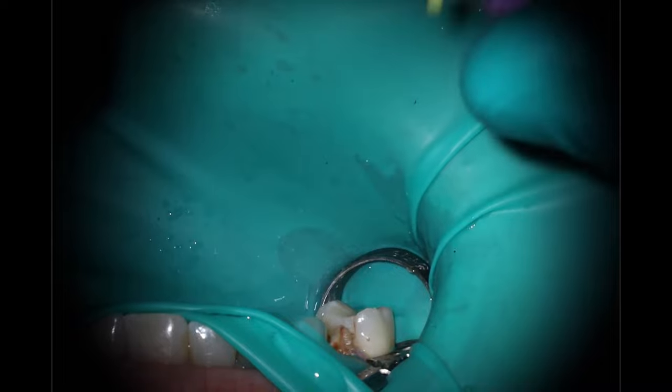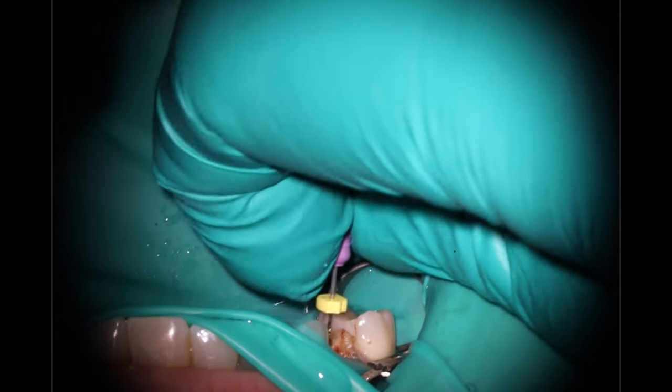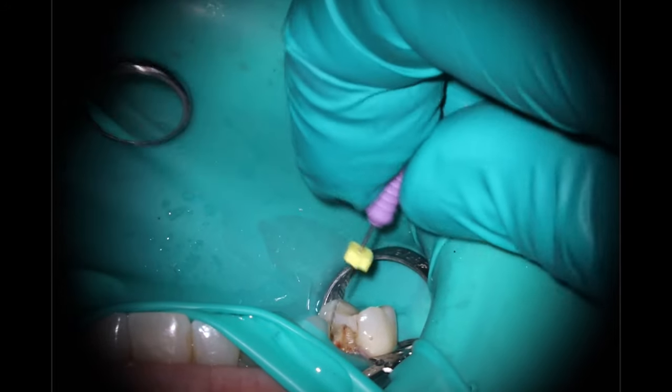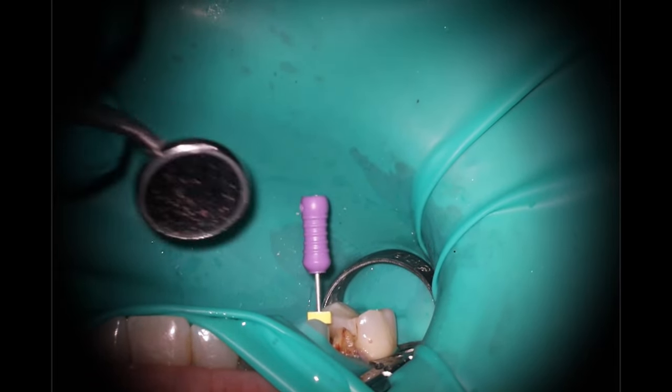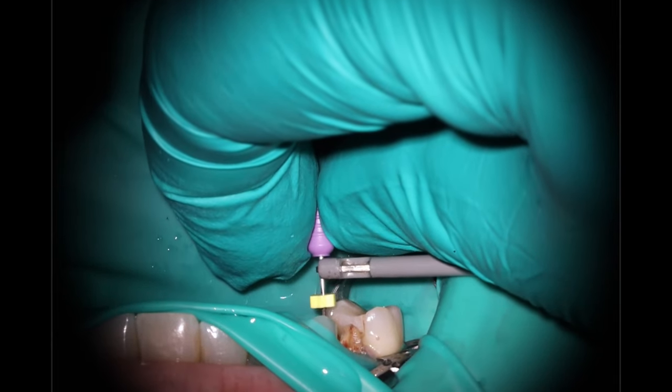I love those rolled handles on the back of the mirror — those are from EIE, really a nice time saver. I do find that curve helpful — I can thank Dr. West for that. Back in 2012, he showed me that you need to put that little bend to get around the corner. So if you're having trouble getting down a canal, even if it's pretty straight, put just a gentle bend, and oftentimes you'll find you can go right on down after that.